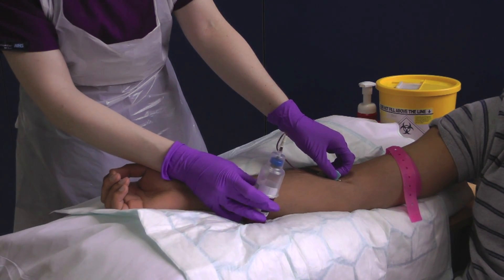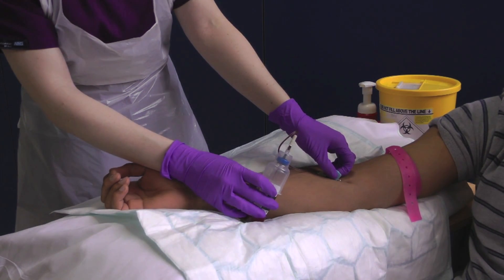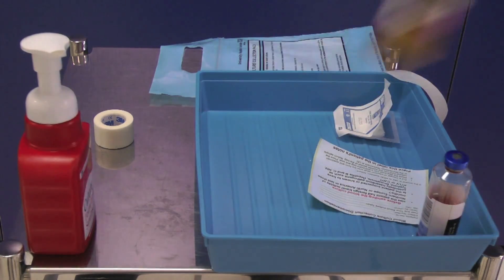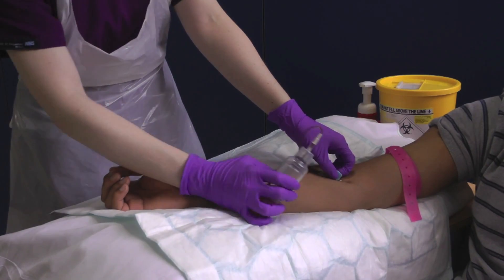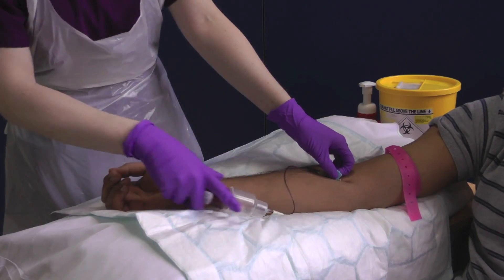It is important to fill the aerobic bottle first, as there will be air within the collection set. Hold the bottle upright and collect 10ml of blood. Remove the aerobic bottle and repeat the procedure with the anaerobic bottle. Remove the anaerobic bottle and release the tourniquet.